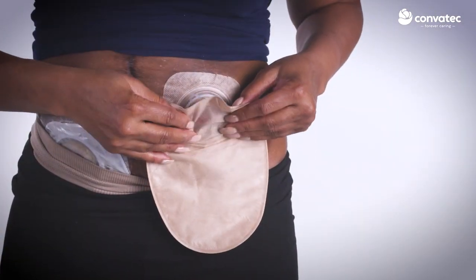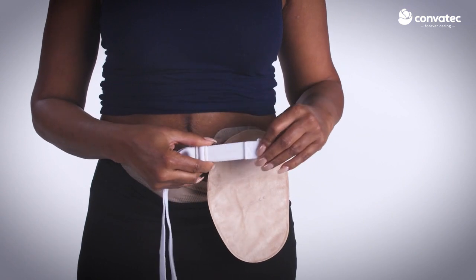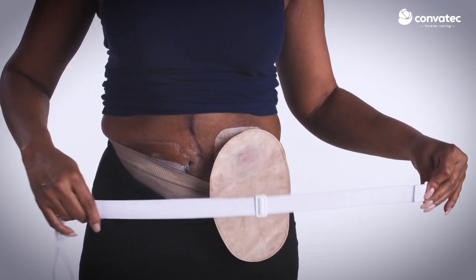First, apply your pouching system according to the package instructions. The Convatec ostomy appliance belt is adjustable to 42 inches. Modify the length to suit your size.